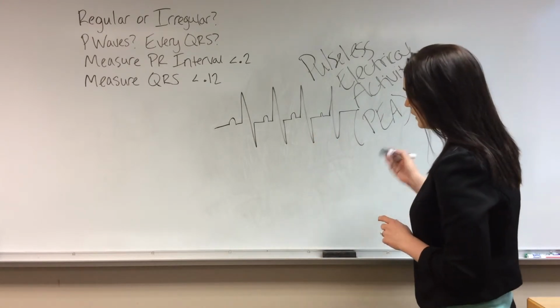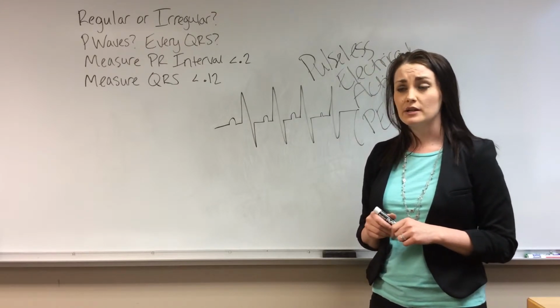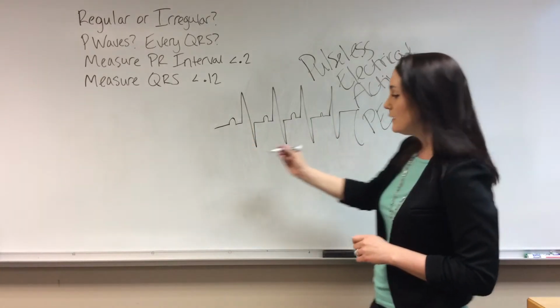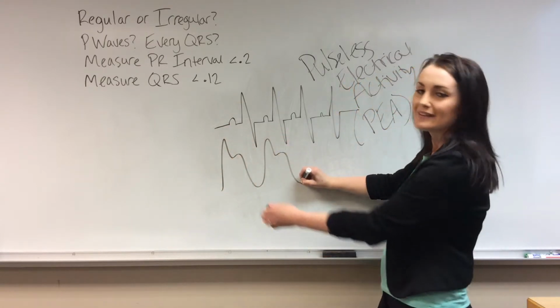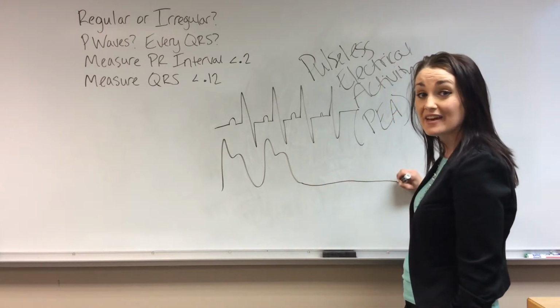So in the ICU, we have the luxury of arterial lines, which we can monitor blood pressure beat by beat. And what we would see is a normal looking rhythm for cardiac, but then your arterial line, which would look something like that with normal beats, slowly just goes to nothing.